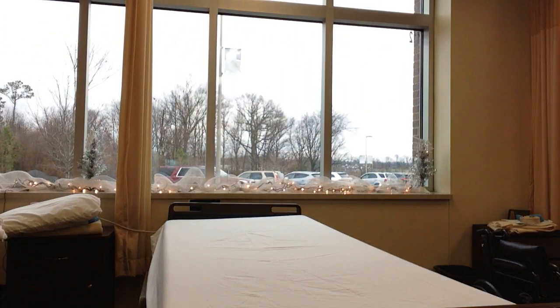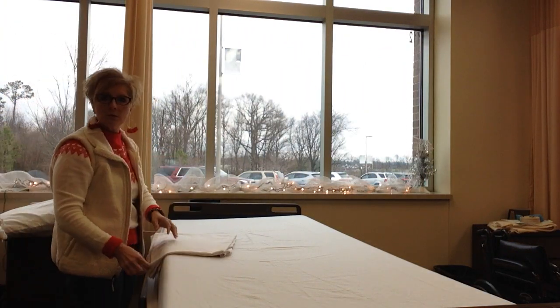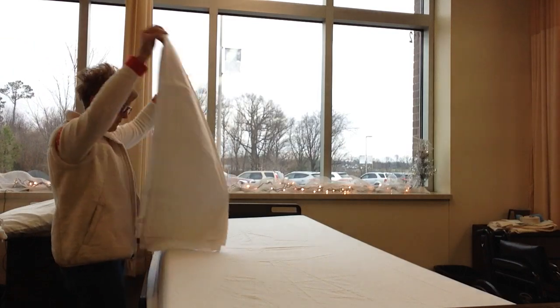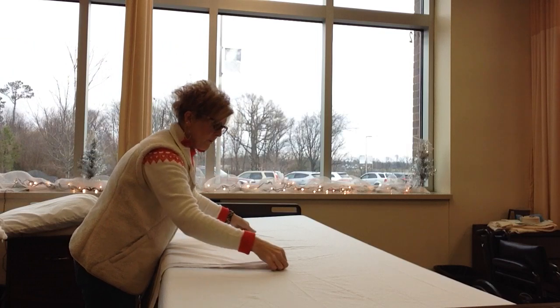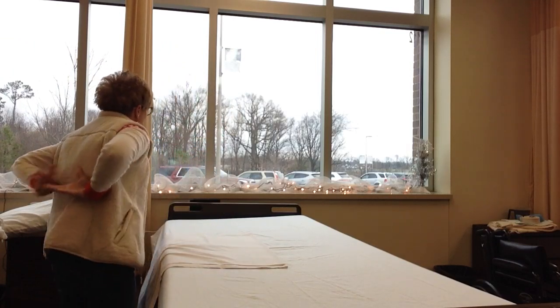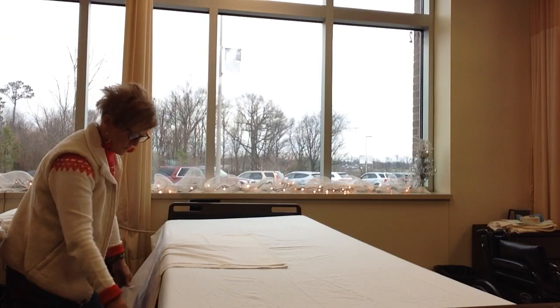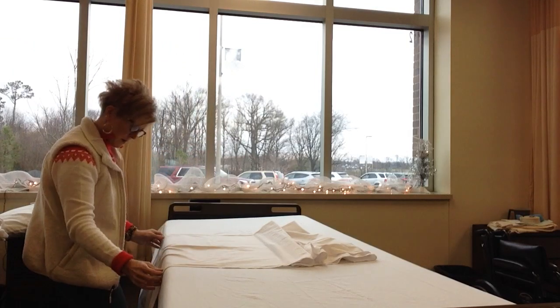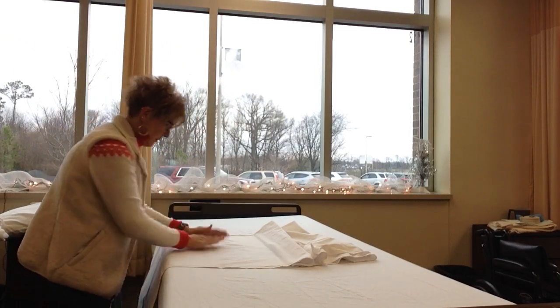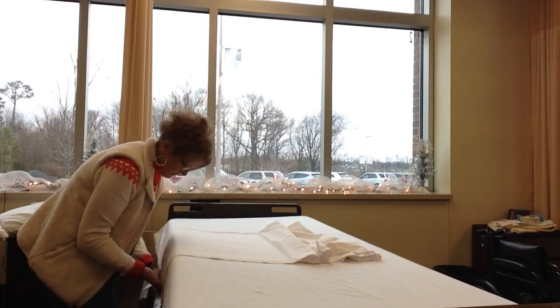Once we have their bottom sheet on, we're going to put their draw sheet or lift sheet on. Remember that it goes in the middle third of the bed. So if we were thinking about it in relation to the resident, it's going to go below the shoulder to up above the knee. Go ahead and tuck it on this side.